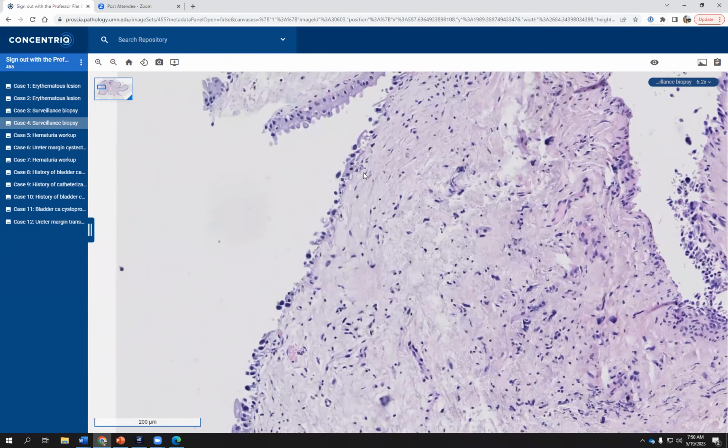And this is a type of carcinoma in situ which denudes very easily, because the cell-to-cell adhesion in carcinoma in situ is often lost. And some people term this a denuding cystitis. So denuding cystitis is just another term that is used by clinicians and pathologists for carcinoma in situ that sheds off the surface, okay?